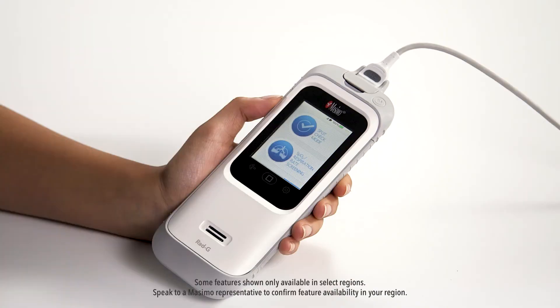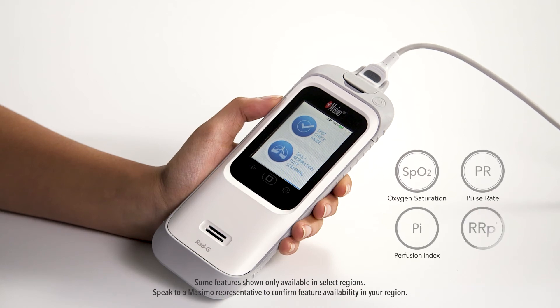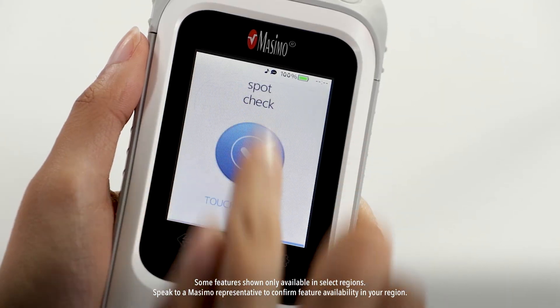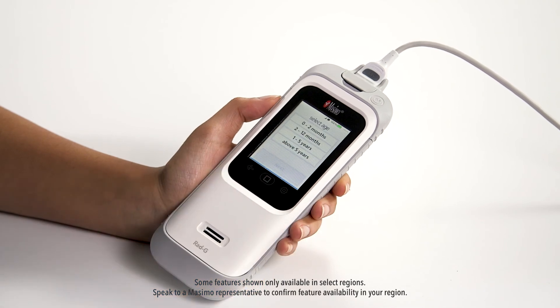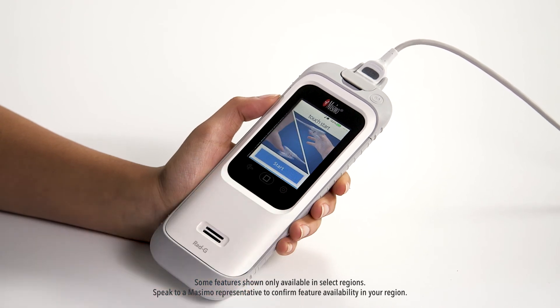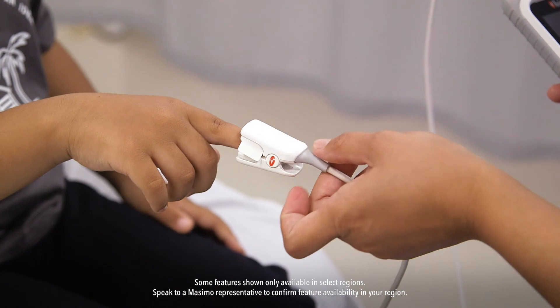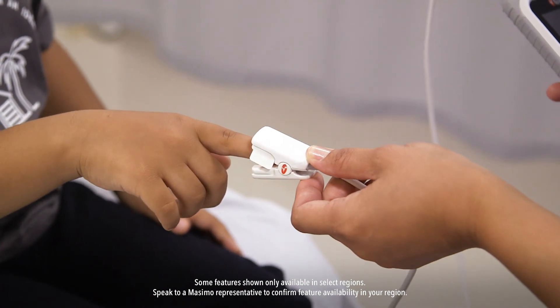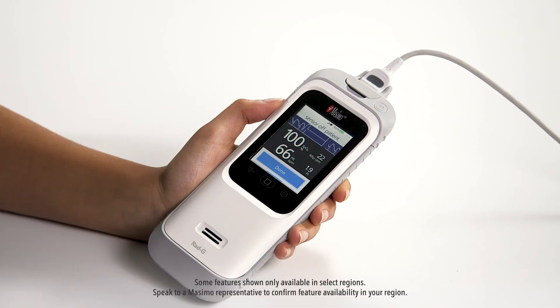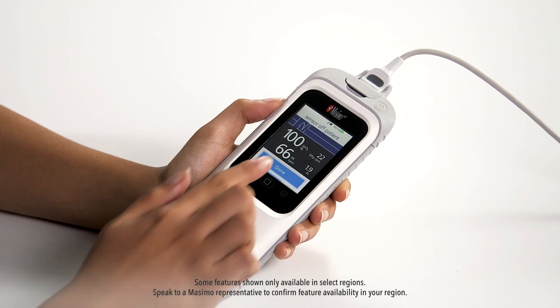RadG also allows for spot checking SpO2, pulse rate, perfusion index, and respiratory rate. To begin, select spot check mode. Touch the spot check touch to begin screen to proceed. Next, select the age of the patient from the list provided. Proceed to place the sensor on the patient as described previously. RadG will begin searching for a pulse and the display will change to a measuring screen. Once measurements have been obtained, remove the sensor from the patient. RadG will indicate a sensor off patient message. Touch done to return to the mode selection screen.